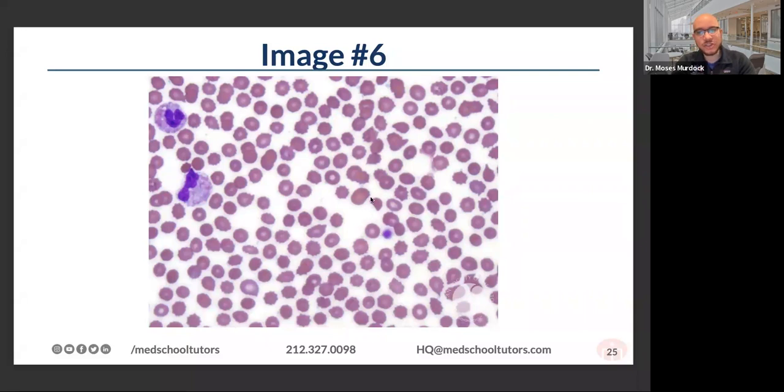And that also makes the point that for the purposes of your exams, they will show you classic pathology, and there's only one right answer, essentially, is what I'm trying to get at. But in real life, sometimes you can see the occasional schistocyte. And the truth is that there are more advanced criteria about how many schistocytes you see in a high-powered field.